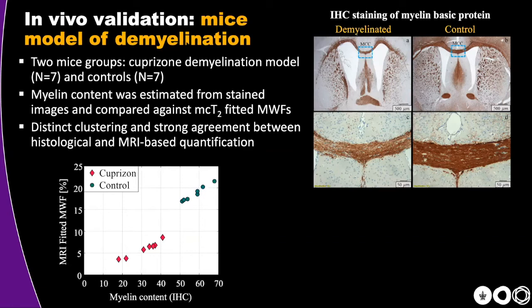Or you would want to compare your values with your colleague who works on a GE scanner, because we're doing all this on Bruker scanners, on Siemens scanners, and on GE scanners for now. And this is where getting values that are invariant to protocol implementation and parameters is important. So yeah, you could use biased values to study disease, but there is some disadvantage to it.